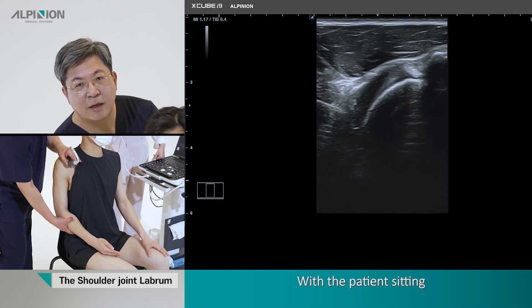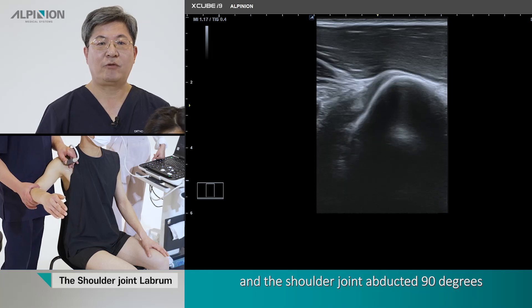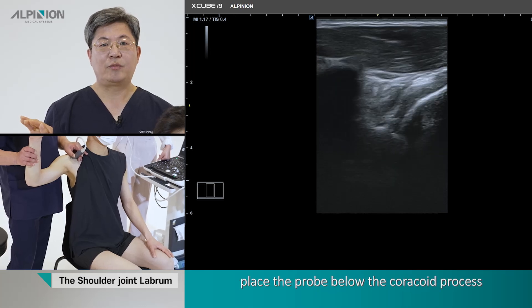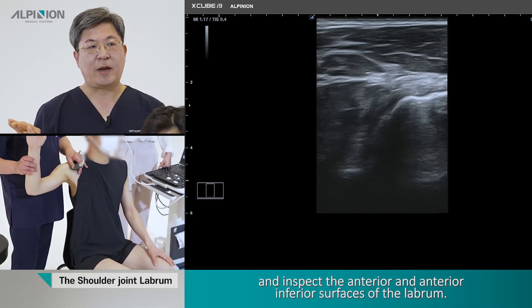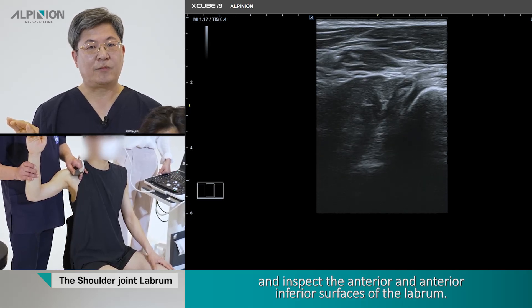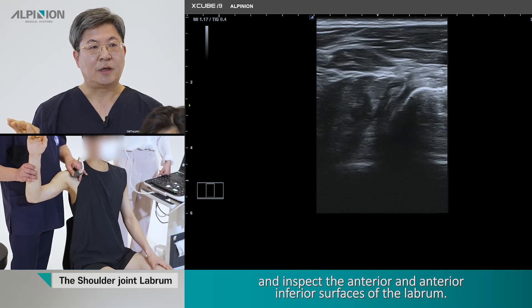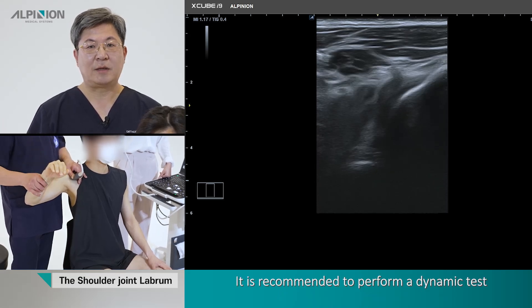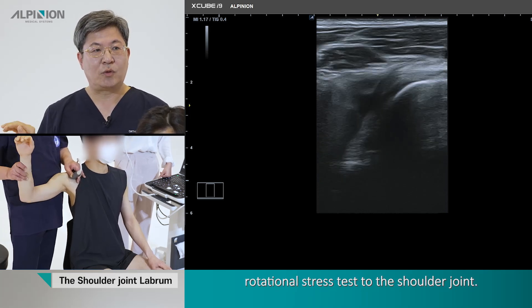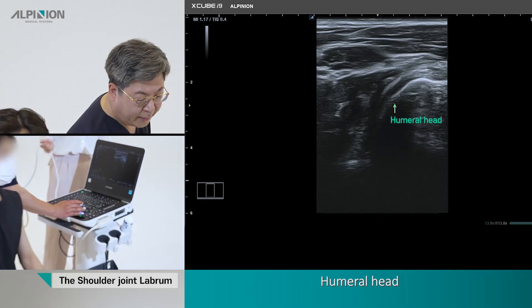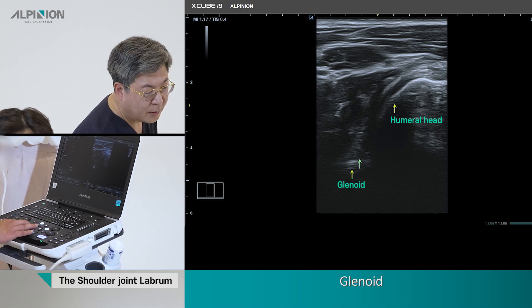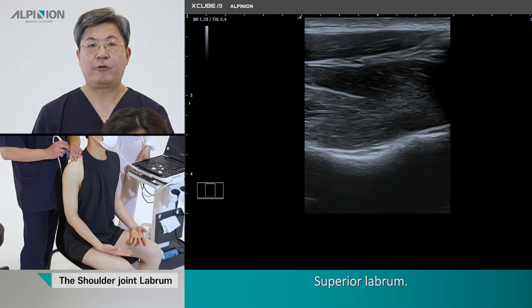Anterior labrum. With the patient seated and the shoulder joint abducted 90 degrees and externally rotated 90 degrees, place the probe below the coracoid process to inspect the inferior and anteroinferior surface of the labrum. It is recommended to perform a dynamic test by applying the anterior drawer test and rotational stress test to the shoulder joint.